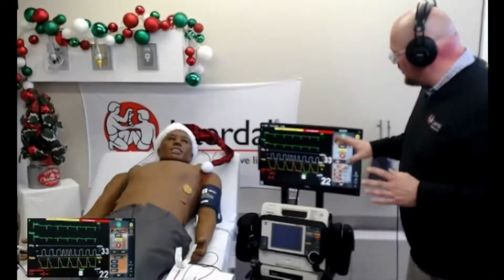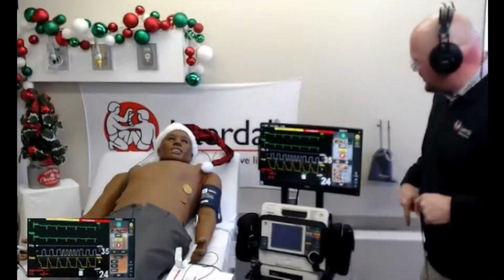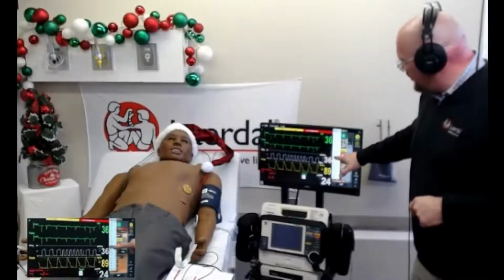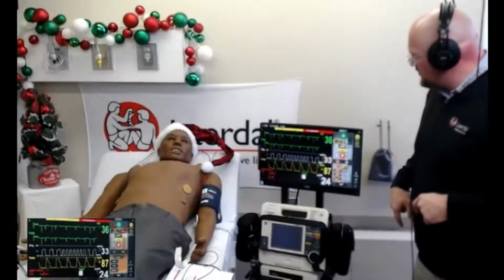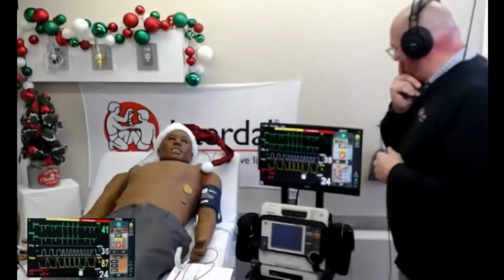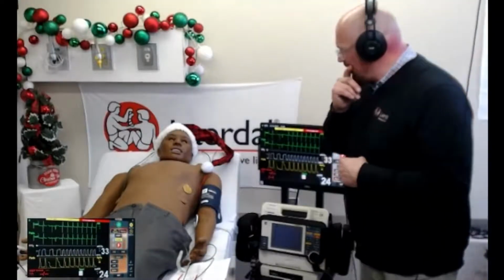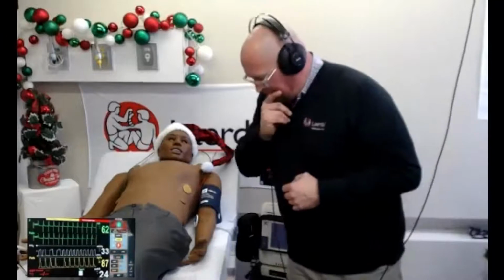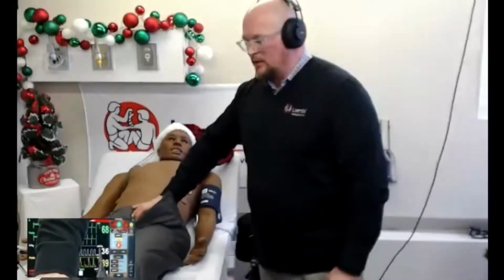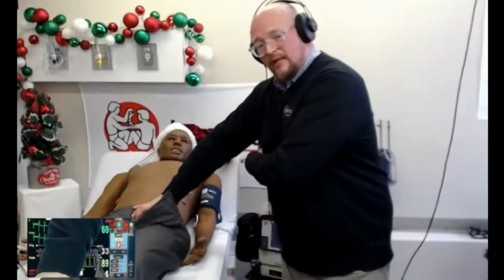All right, you're okay now? All right, you're still sweating. All right. So we can actually turn on the pacer here. We still have the ability to change the rate. We still have the ability to change the output. So I'm just going to, I kind of know the secret of what the threshold is. Sorry, there's some sedation. There you go. And so now when I go back, I should be feeling a pulse of 60 or whatever my pulse per minute is set.